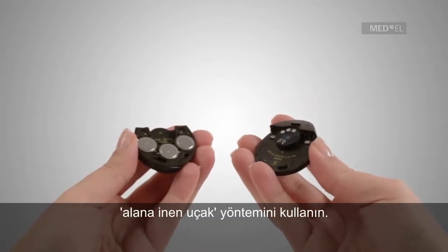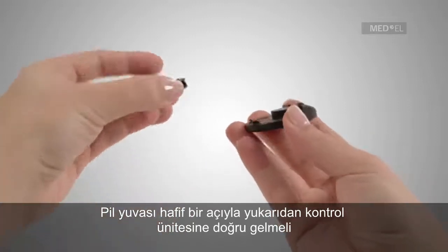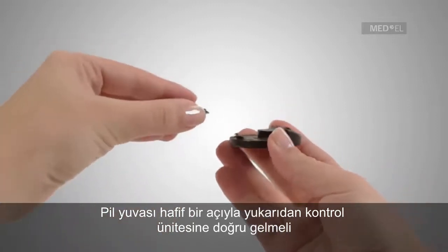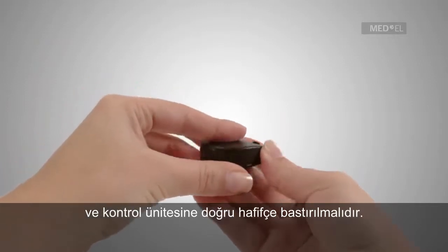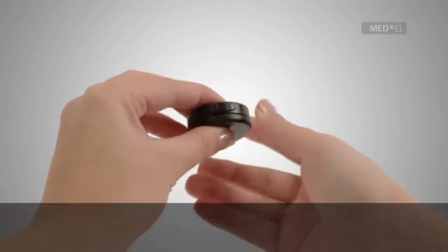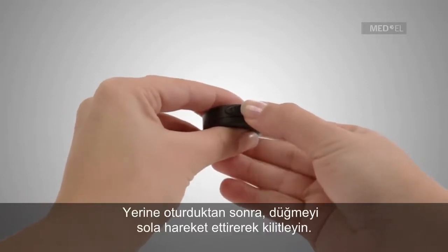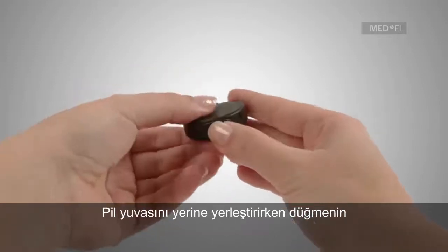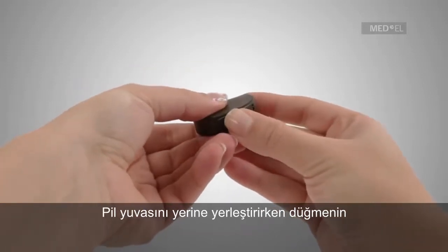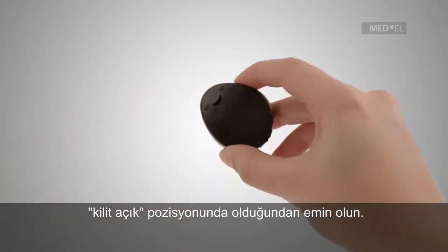To reattach the battery pack once the batteries have been changed, use the gently landing airplane method. The battery pack should come in at a slight angle against the backside of the control unit before being gently pressed towards the control unit. Once at rest, move the switch toward the left to lock. Assure that the switch is in the unlock position when attaching the battery pack.